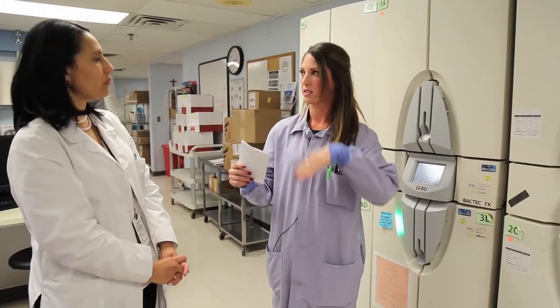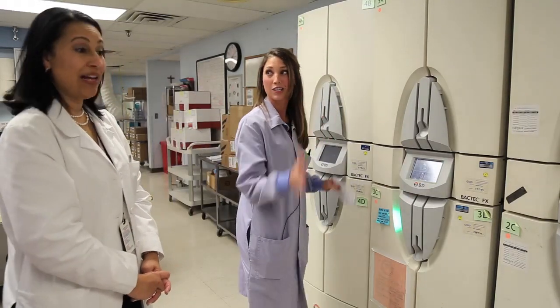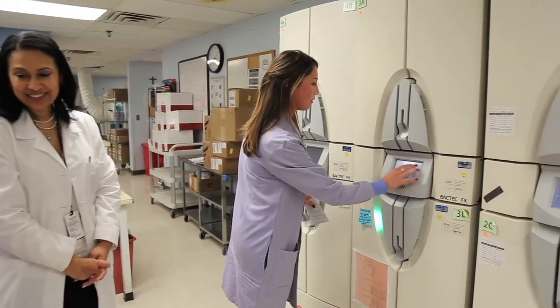And once it crosses this peak threshold, it creates a fluorescence in the bottom of the bottle, and there's a sensor that is detected by the slot that we put it in. And so once that happens, this goes positive. And if you don't mind, I'm going to demonstrate what it looks and sounds like when one goes positive.